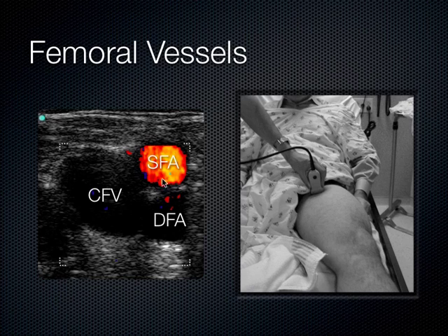So let me ask you guys a question. Knowing full well that the indicator goes to the patient's right, this is a transverse view of this patient's common femoral vein, superficial femoral artery, and deep femoral artery, okay? Let me ask you something. Just based on this, knowing that venous is more medial to the penis, venous penis, which leg is this, the right leg or the left leg?